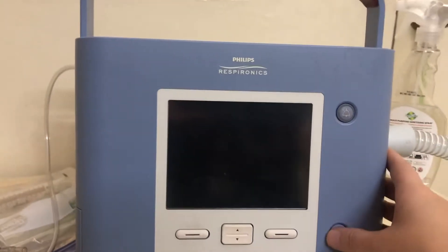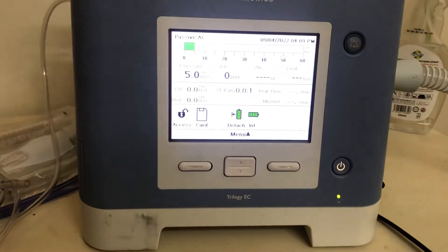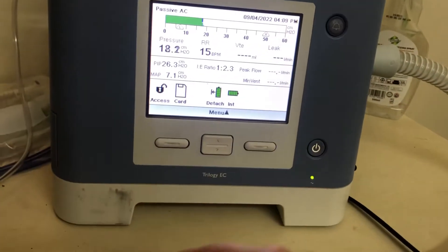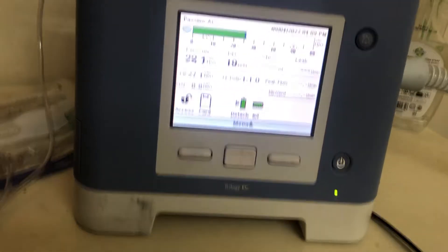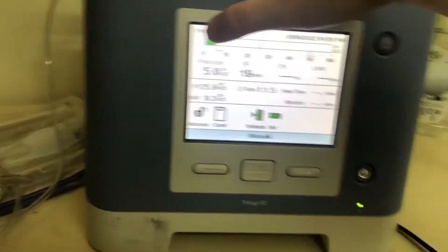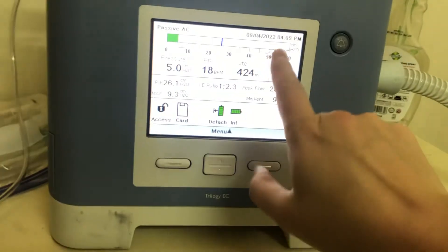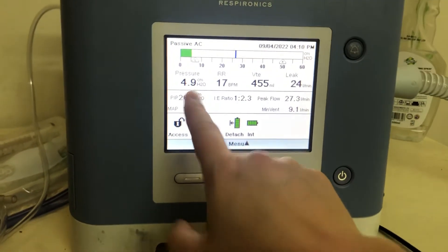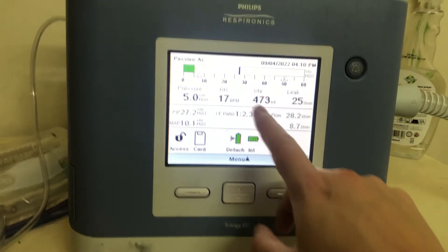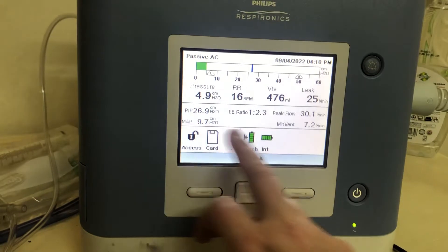To turn the machine on, just hit the power-on button and it will automatically come on to the last settings. You can see the current mode up here — we're right now on passive AC, which implies this exhalation port. This is a pressure graph showing our pressures; the L and H are our high and low pressure alarm settings. We can read pressures numerically, the respiratory rate, the estimated exhaled volume — though it's not actually measuring it — and then leak and some more values.